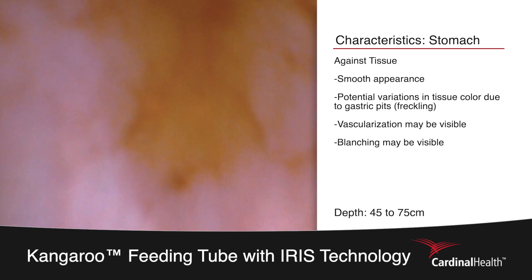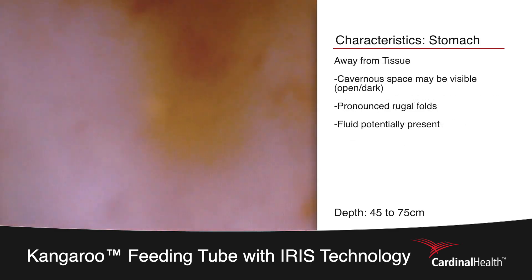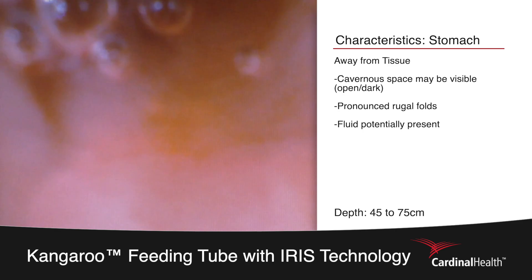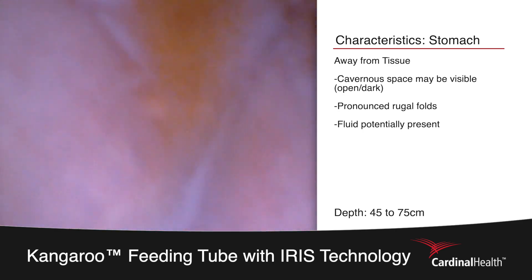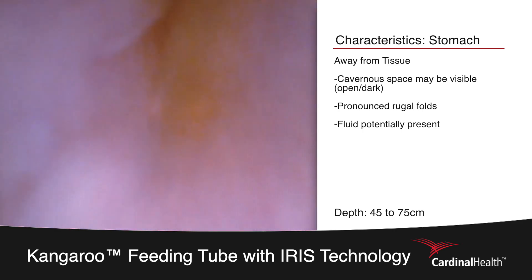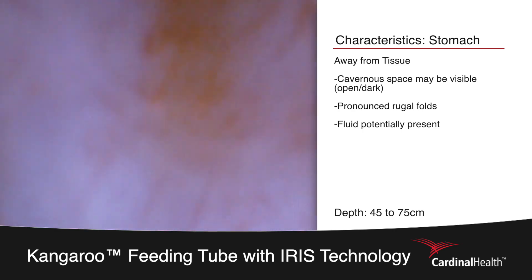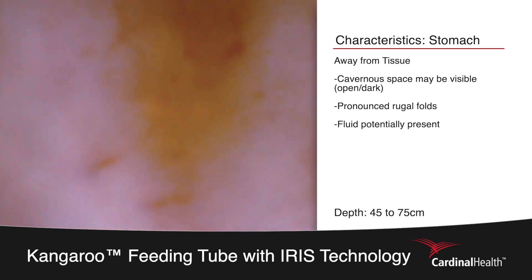In order to visualize the rugal folds of the stomach, the placer retracts the feeding tube into the esophagus. As you can see, the tissue of the esophagus now collapses around the end of the feeding tube, and then progresses back into the stomach as can be seen by the presence of gastric pits.